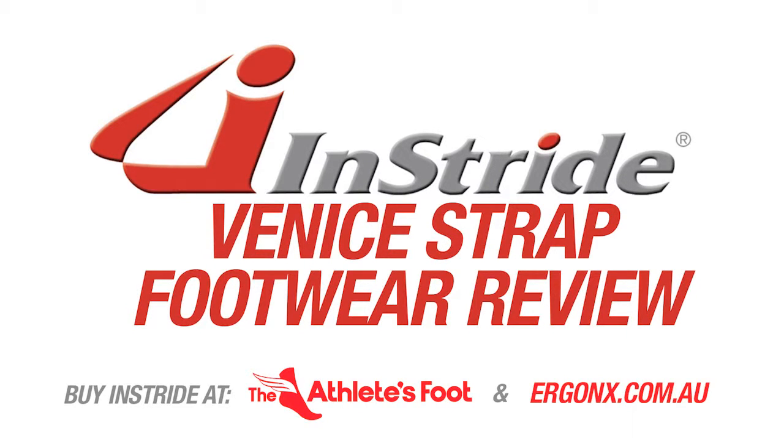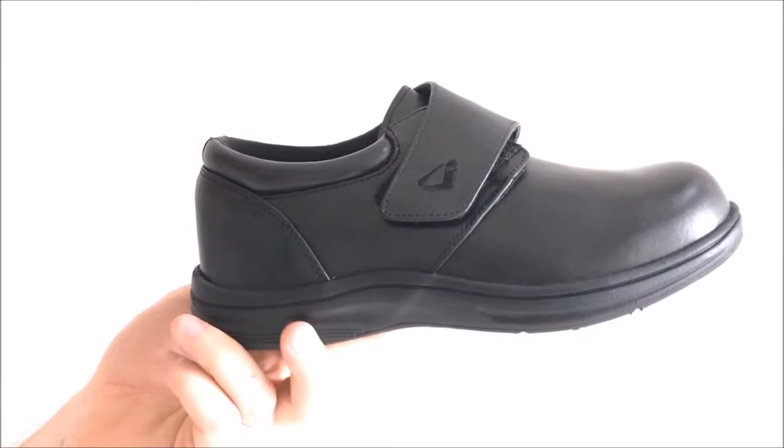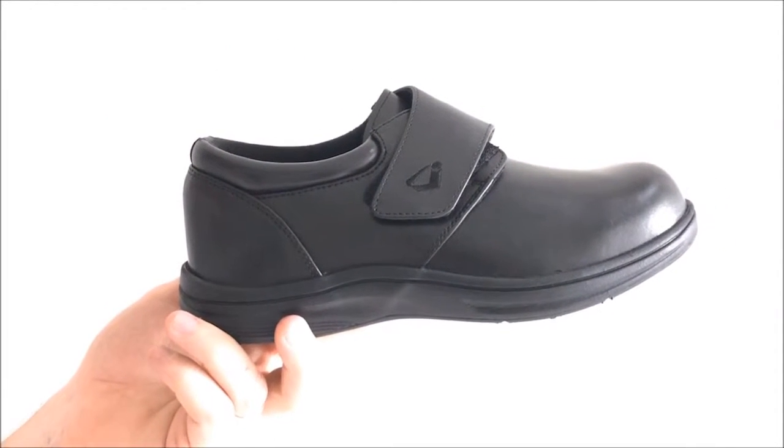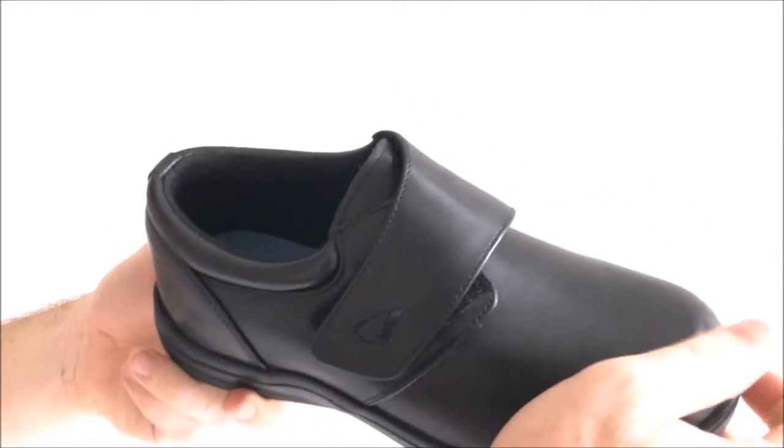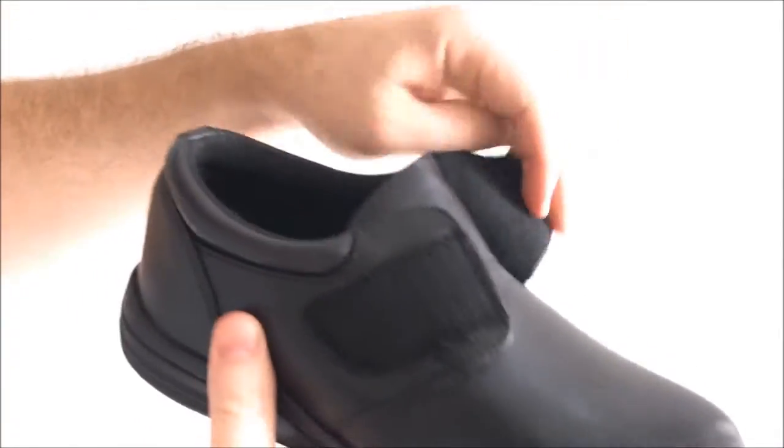Welcome to the Ergonix product review and today we'll be reviewing the Instride Venice Ladies Velcro Strap Shoe. The Venice is a full grain leather, extra width, extra depth ladies general purpose shoe. It has a Velcro adjustment to help it fit the widest or the narrowest foot.